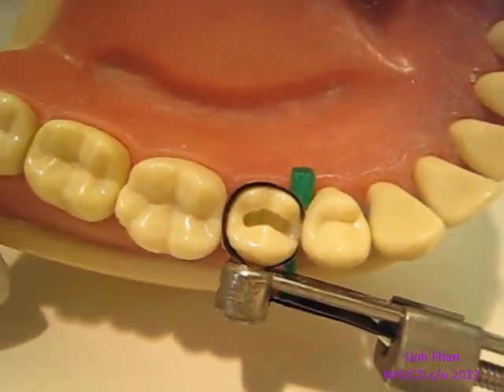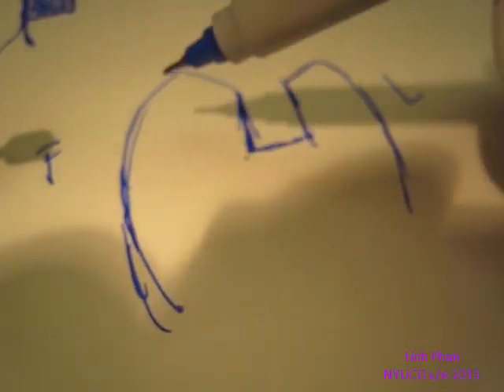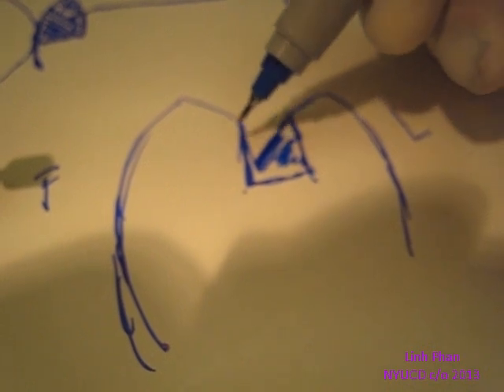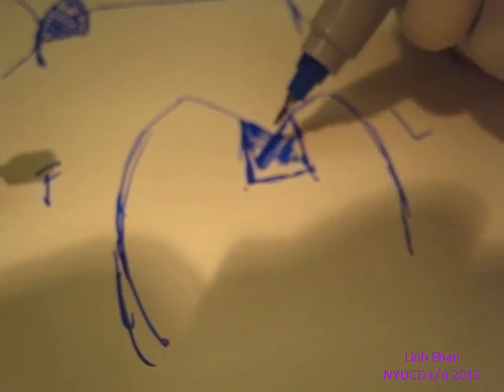Now that we have our marginal ridge, let's fill in the rest. I'm going to use this little diagram here. This is the facial side of your tooth and here's the lingual. We're looking from a mesial view and we're going to start building and filling this in. We're going to use the cusp as guidance, fill in this part, cure it, then do the other side and cure it — and then you have your groove, so you don't have to do as much work to get that anatomy.